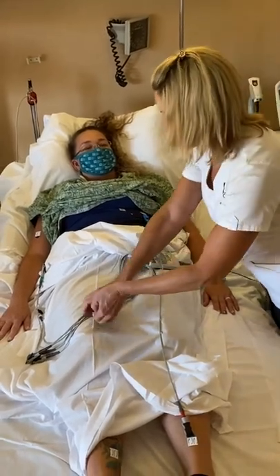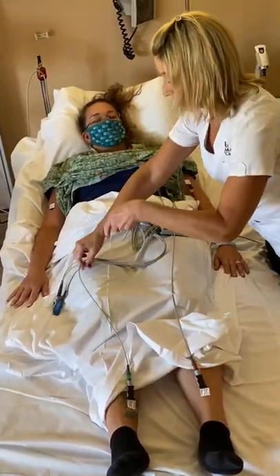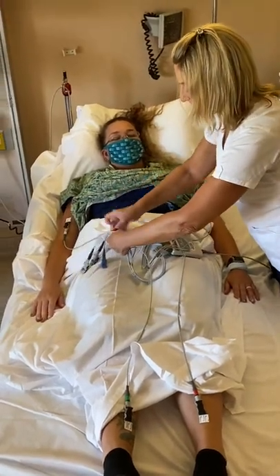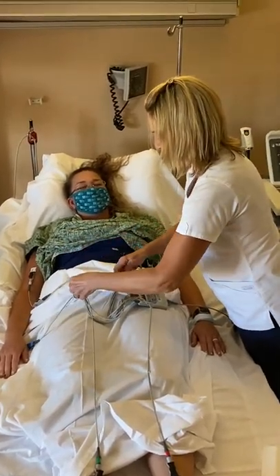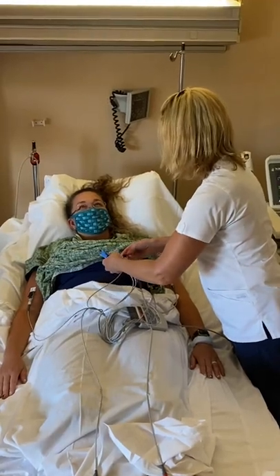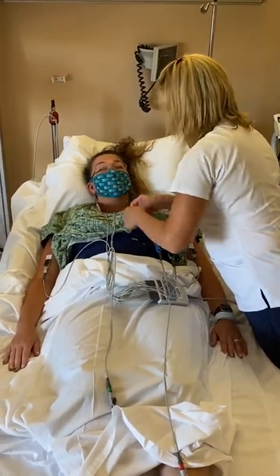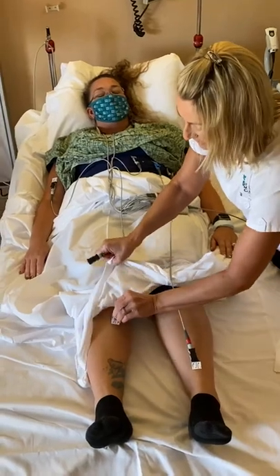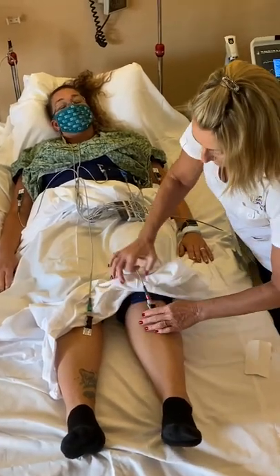The tail is old as time, trying to keep these untangled. Now we're going to do right leg, right arm, and then one, two, and three. So one, two, three. And if you have the problem I just had, so my limb lead will not stay connected, you can move it up as long as it is somewhere on their limb. I have long legs, that probably doesn't help.